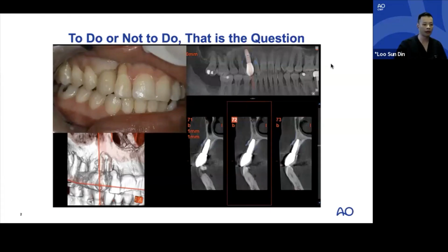A motivational speaker comes along looking like this, basically afraid of smiling in public and terrified of showing her gum line. On examination, the 1-2 is shaky, with all-around gingival swelling and no buccal keratinized tissue. We follow up by shooting a cone beam CT to find severe periimplantitis in 1-3, with around 6 to 8 millimeters of bone loss around 1-2 and 1-3.